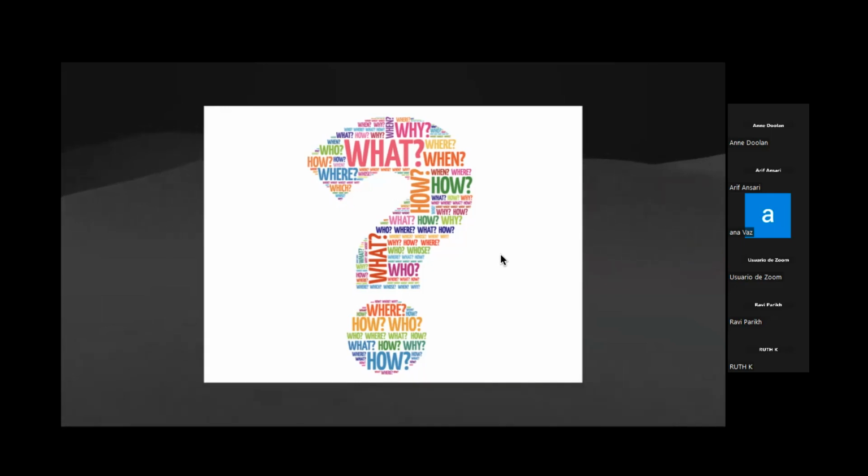So when you are learning it, bringing in those lines, with the A and B lines and comet tails, sort of complicates the picture. It's too much to come to the diagnosis. So I will stick to A lines, B lines, comet tail artifacts, and pattern recognition to begin with. And as we progress with the pathologies, yes, we can definitely touch upon it. But answering your question, is the Z line a comet tail artifact? No.